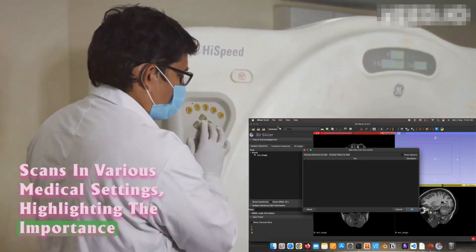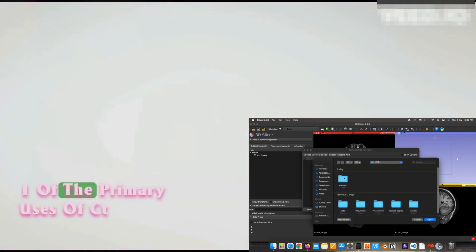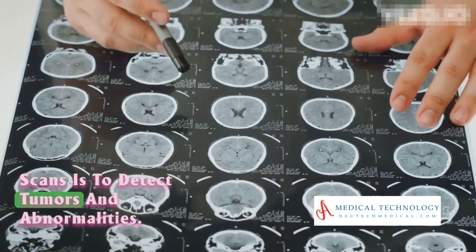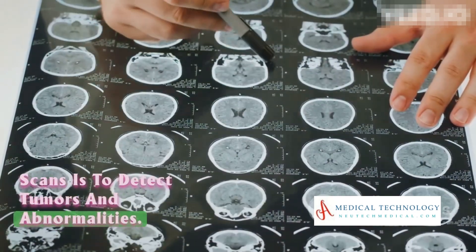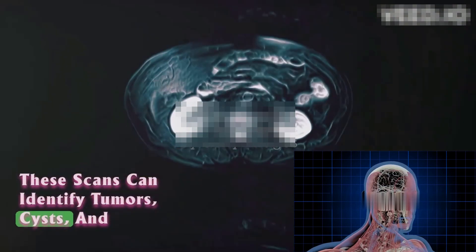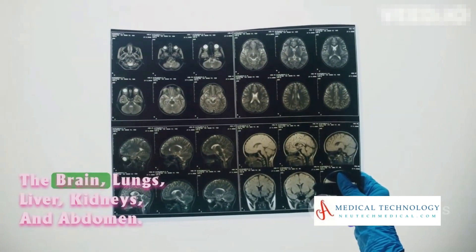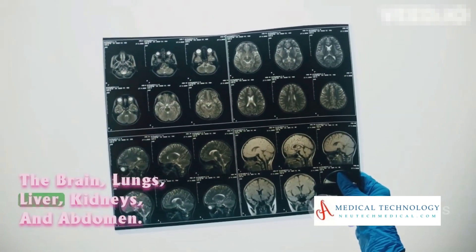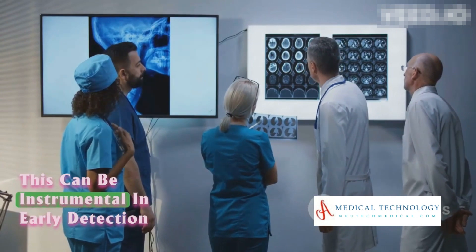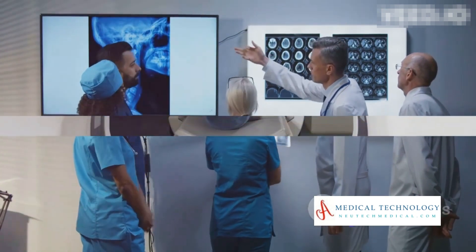One of the primary uses of CT scans is to detect tumors and abnormalities. These scans can identify tumors, cysts, and other abnormalities in various organs, such as the brain, lungs, liver, kidneys, and abdomen. This can be instrumental in the early detection and treatment of conditions like cancer.